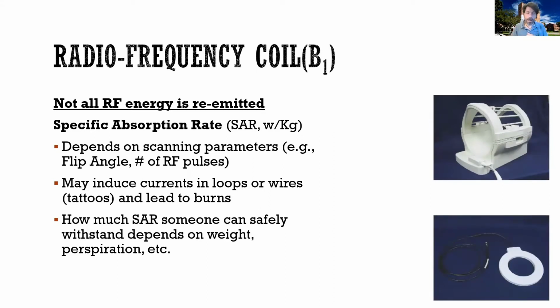If you think back to when we were learning how to take protons that are inside B0 and push them out of B0, you remember that what we said is that you have to slowly push them, right? And you have to push them at their Larmor frequency. Now, in order to do this, you're giving a lot of pushes, and it takes time to push protons from inside B0 to a certain angle from B0. So the greater the angle at which you want to push protons, the longer you have to push for. If you use a flip angle of 10 degrees, you might only have to push for a little bit. If you use a flip angle of 90 degrees, you will have to push for longer. And as you push for longer, you're injecting more radio frequency. So, of course, if a sequence requires more radio frequency pulses, again, you're injecting more energy.